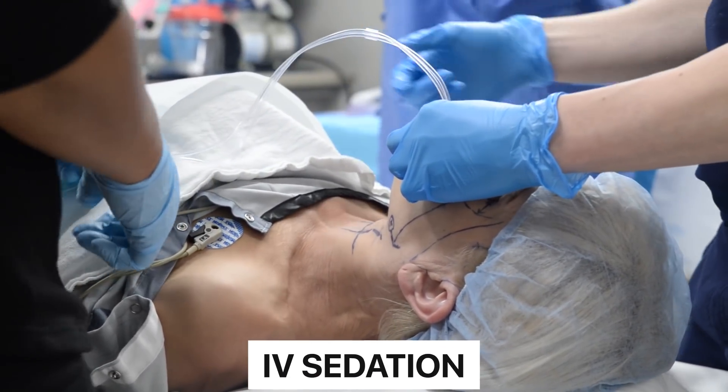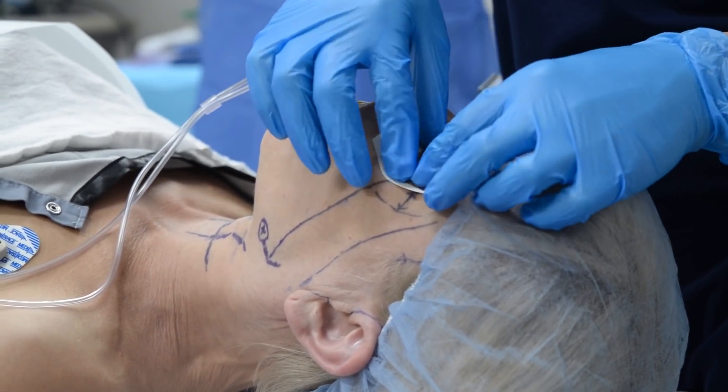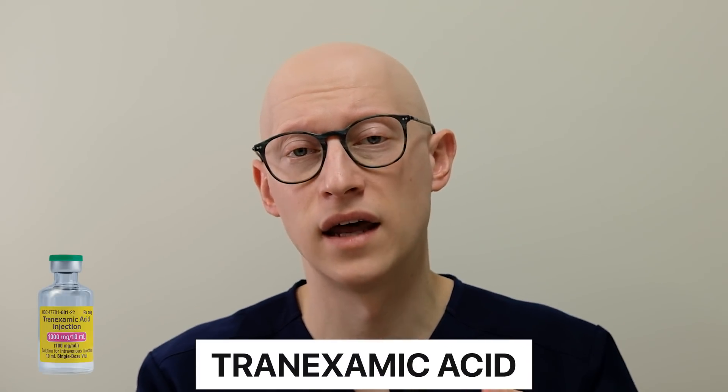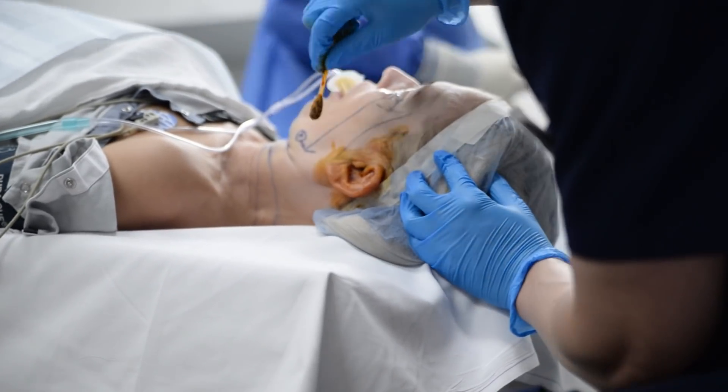Intraoperatively, patients get IV sedation. We protect the eyes, as you see us doing here. Tumescent anesthesia is what we use — a diluted combination of lidocaine and marcaine in a bag of saline. We also put tranexamic acid in there, which is used to reduce bleeding during surgery and also reduces bruising after surgery. We do about 50 cc's of fluid in each area — in the neck and then the sides of the face. We control the hair using autoclave tape and staples, prep the patient with betadine, and drape everything sterilely.